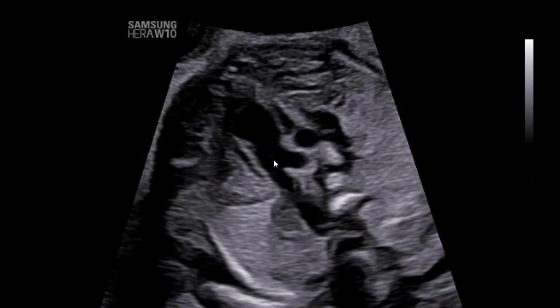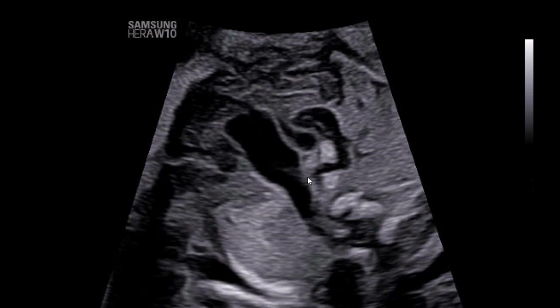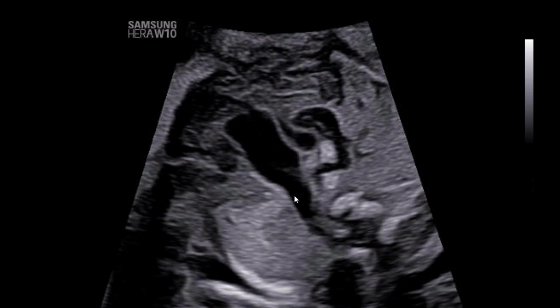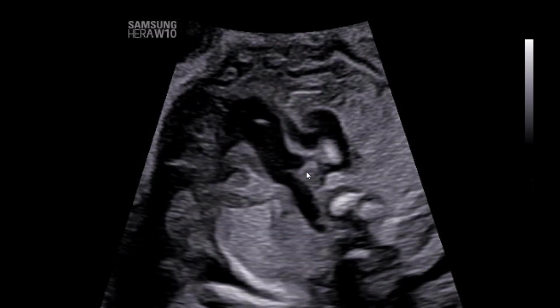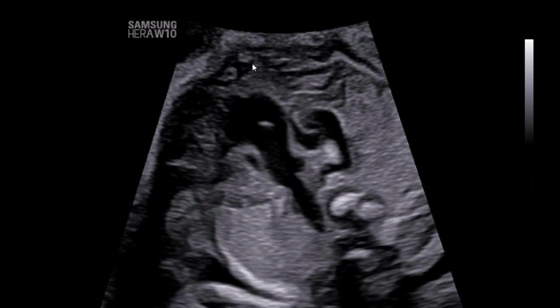And as we have swept just slightly more cephalad, we see that that other vessel turns into this circle, and we can gather that that's likely the ascending aorta. Again, this vessel here, this looks like the left pulmonary artery, that looks like the right pulmonary artery here, and so we have pulmonary artery and aorta, and then this vessel here is the SVC. So this is a 3-vessel view. And you can see the azygous vein draining into the back of the SVC here. Again, this is the spine, and this is anterior, left, and right.